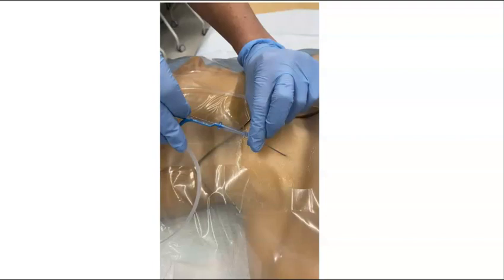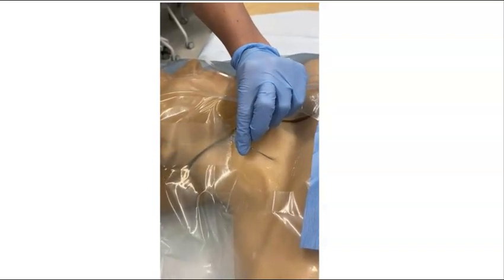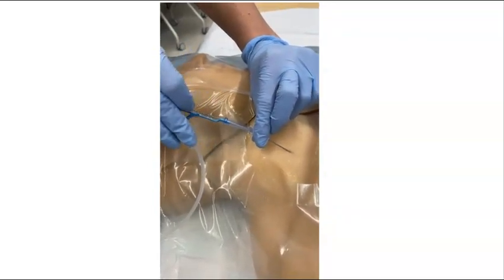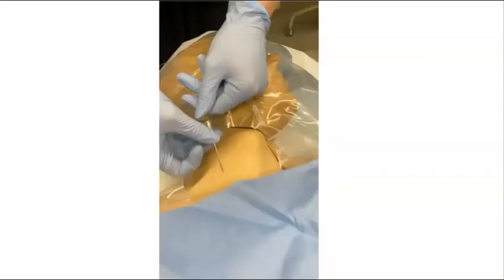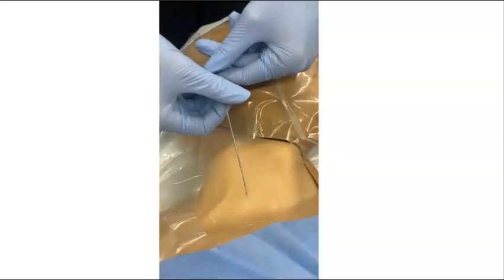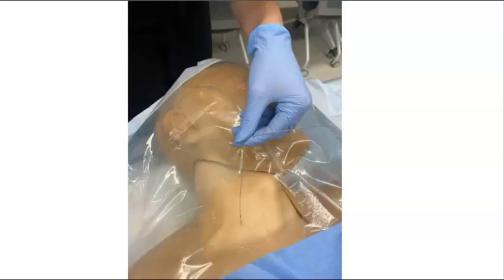Next, you are going to take your guide wire and pass it through the needle as seen in the video. Once your guide wire is about 20 centimeters deep — as indicated by two black tick marks on the wire — you can now remove the needle. Remember, never let go of your guide wire. One hand should always be holding the guide wire at all times, as it is floating in the patient's vasculature and you do not want to lose sight of it. This can be difficult and awkward as the guide wire hanging out from the skin is very long.